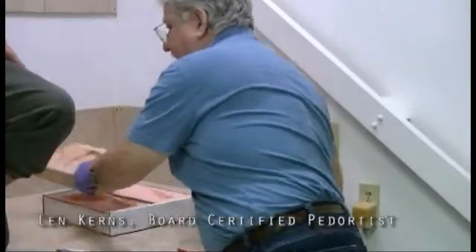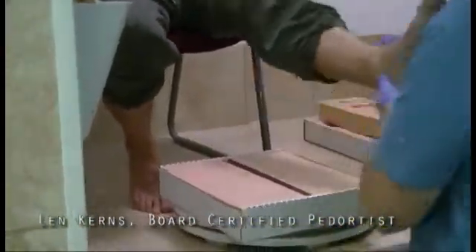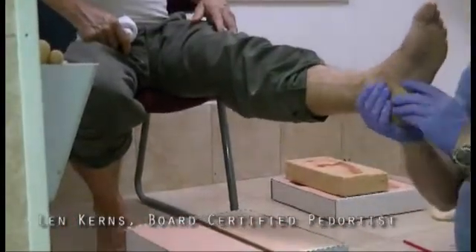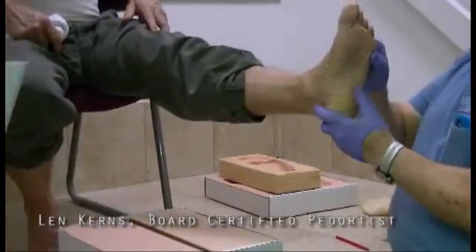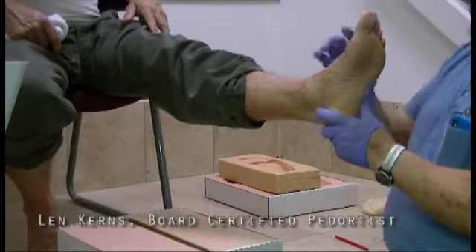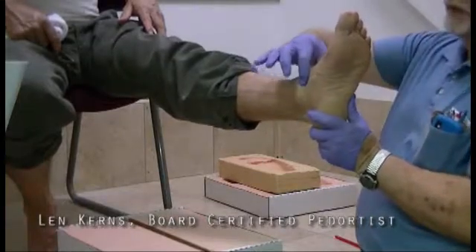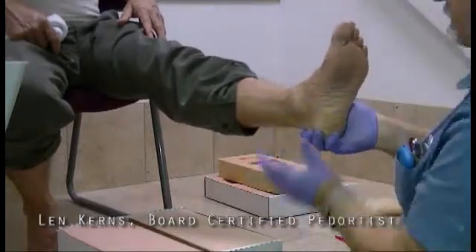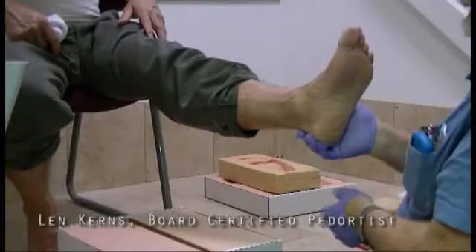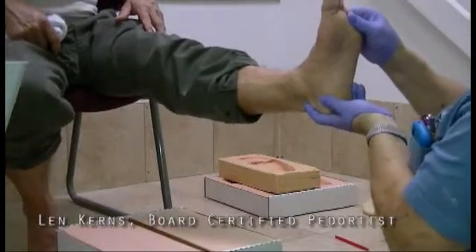So with the patient sitting square in the chair, you take a box of foam, put it on a rotator, and if you ever saw a foot doctor put plaster on, he's locking this foot at 90 degrees to the leg. He's going to turn the heel in, he's going to turn the heel out, until he finds subtalar neutral by feeling for the inner space of the navicular talus joint. And when he finds that, he'll put the wet plaster on the foot, refine neutral again, and then he's going to take his thumb and push the foot 90 degrees to the leg.